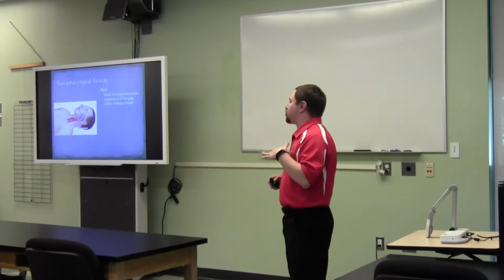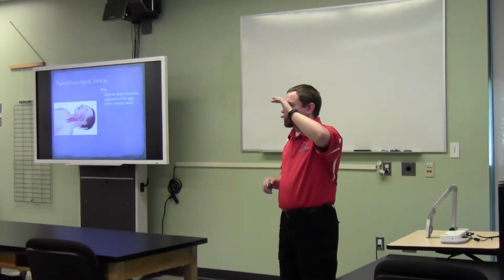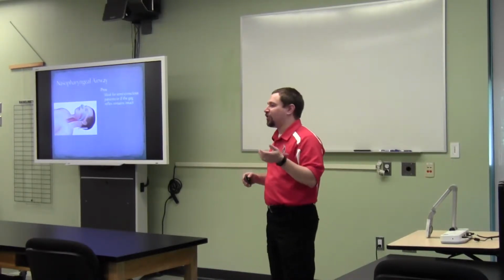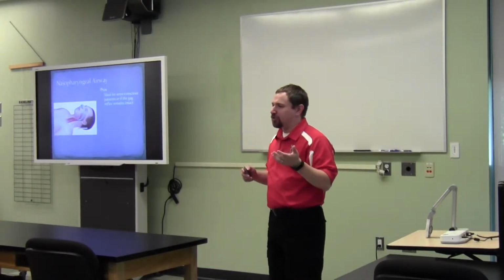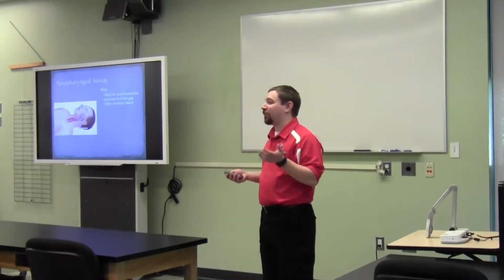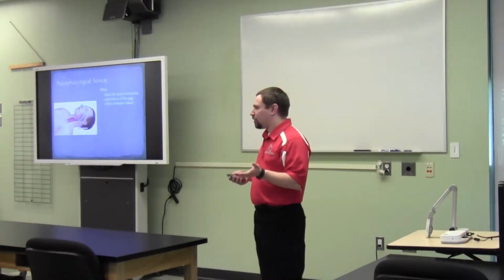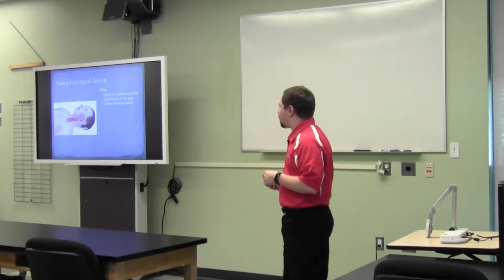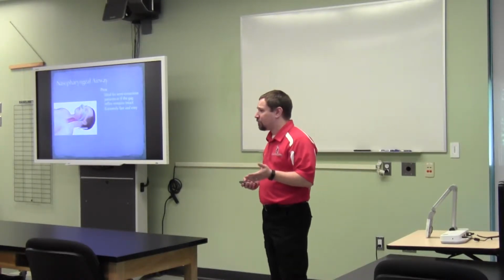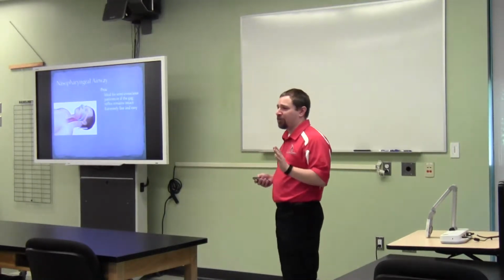So you think about that patient who has got that altered level of consciousness, like they've been hit in the head. They're not completely knocked out, or they're semi-conscious, or they knocked out but they're maybe starting to come to. Someone who's had a seizure. Okay, these are great airways for them, because once they regain consciousness, they're just going to be like, oh, what's this thing in my nose? But they're not going to reject it. Okay, but you still have that control over the airway. Okay, extremely fast, extremely easy. This is actually one of the airways I've used probably the most in my career.